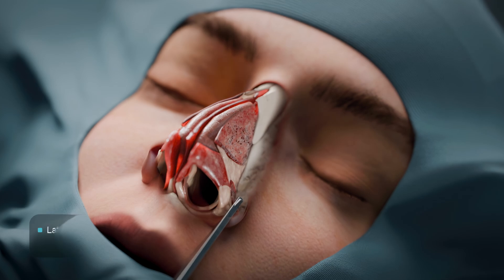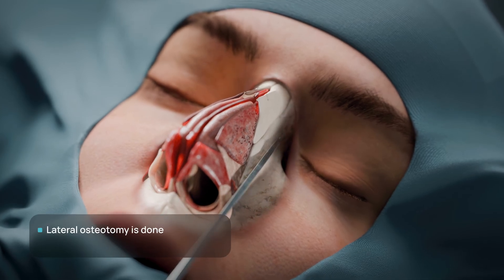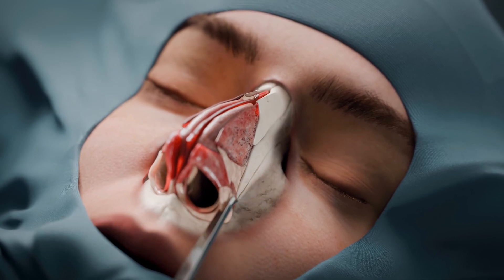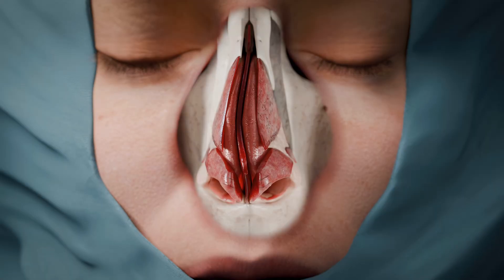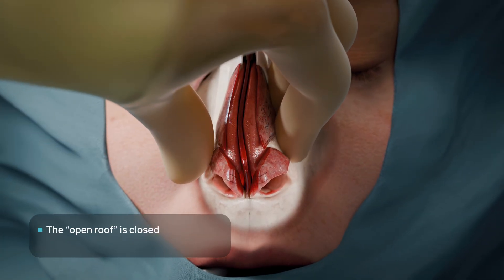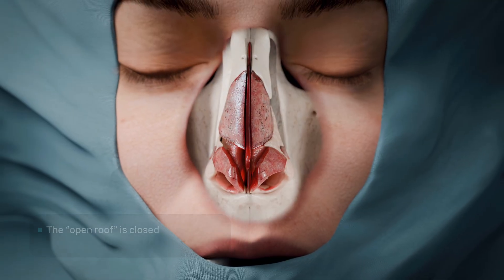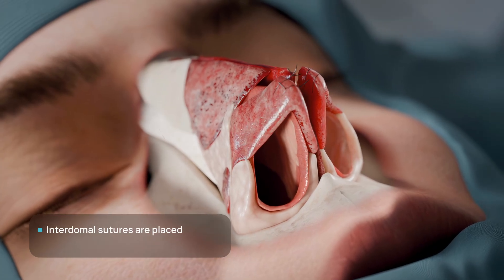The next stage involves lateral osteotomy via controlled longitudinal cuts along the frontal processes of the maxilla. This technique allows for closure of the open roof deformity and narrowing of the nasal dorsum, thereby restoring proper anatomical configuration.